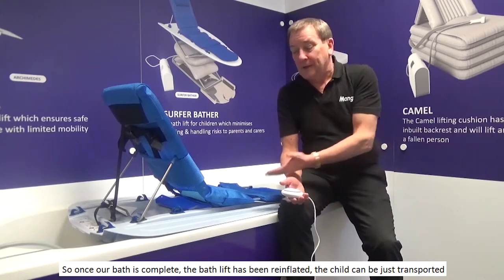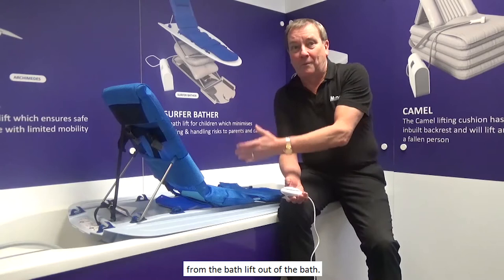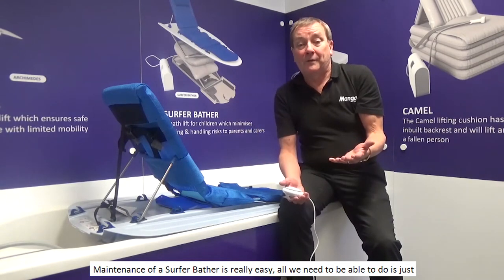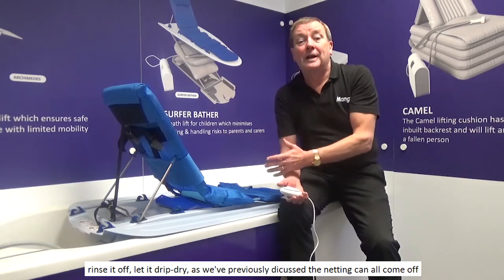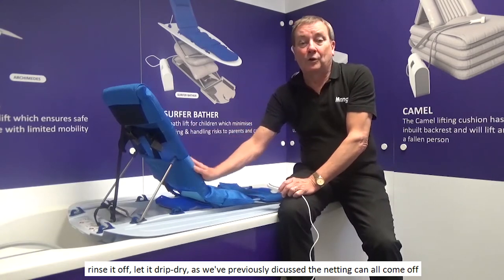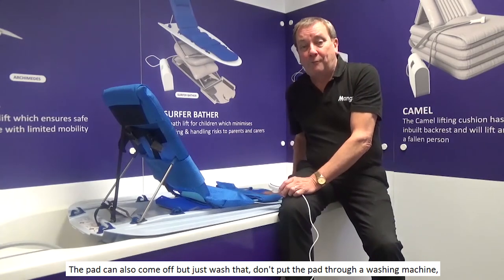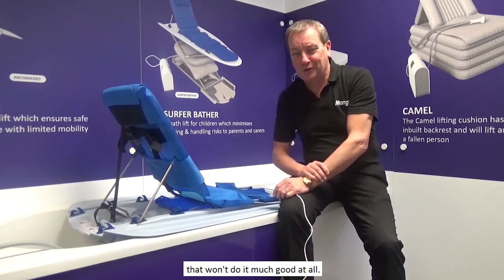Once the bath is complete, the bath lift has been reinflated, and the child can be transported from the bath lift out of the bath. Maintenance of the Surfer Bather is really easy — all we need to do is just rinse it off and let it drip dry. As previously discussed, the netting can all come off and just be washed. The pad can also come off, but just wash that by hand — don't put the pad through a washing machine.